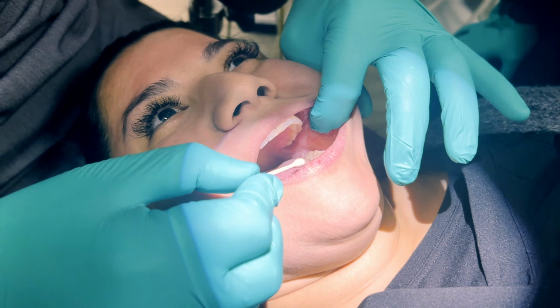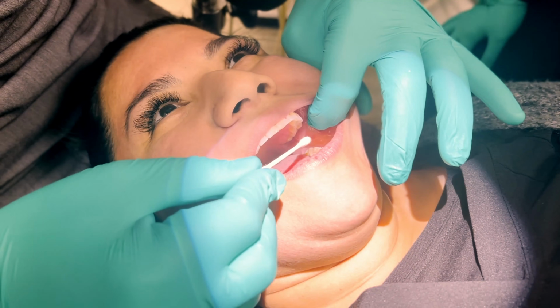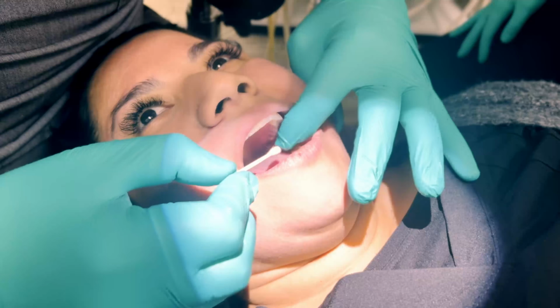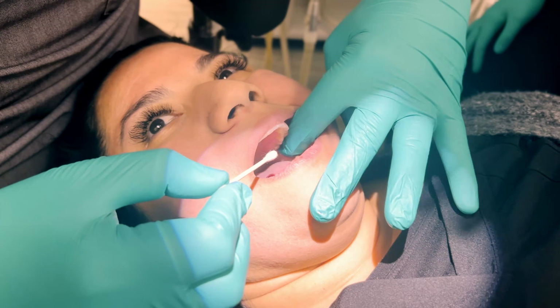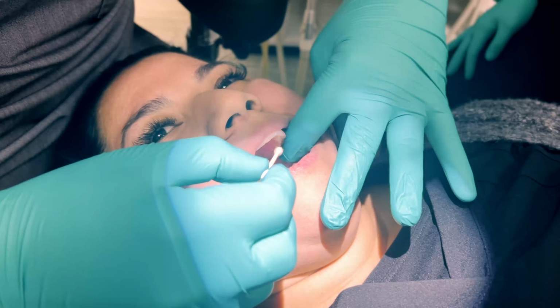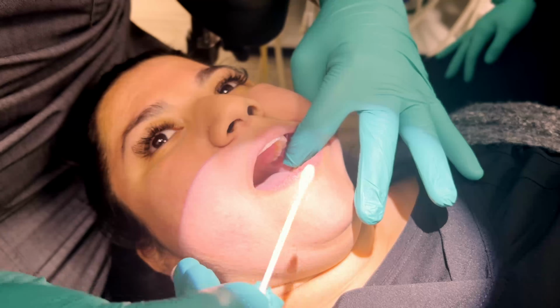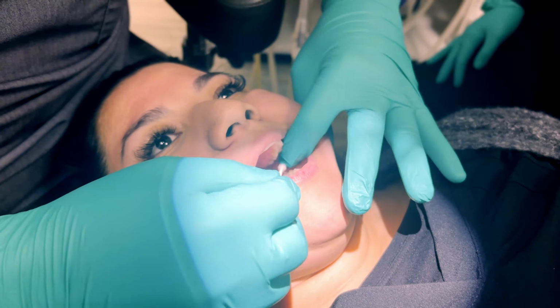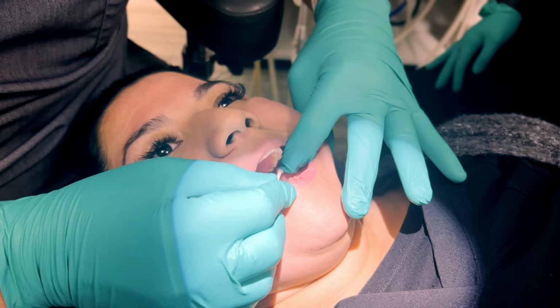All right, so what we're going to be doing here is showing you the two different injection sites. So for an IA, what we're going to be primarily looking at, you can feel the edge of her mandible right here, and there's an indentation. And so for the direct IA, which is how most of you are probably taught, you're going to go right along where the canine is and come in at this direction right here, right where the raphe is.